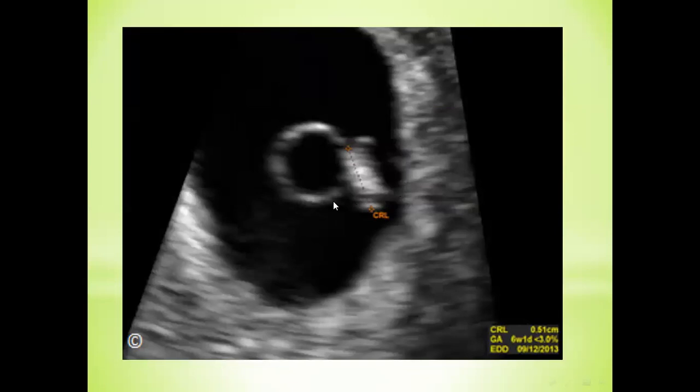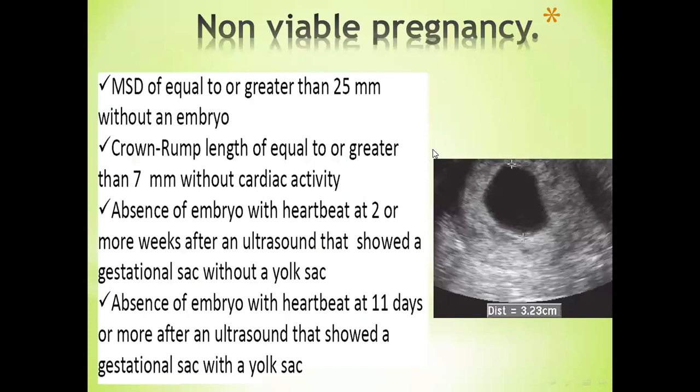After that, there is visualization of the yolk sac and fetal pool, like this, and there is another very important sign to confirm progression or development of the intrauterine pregnancy.